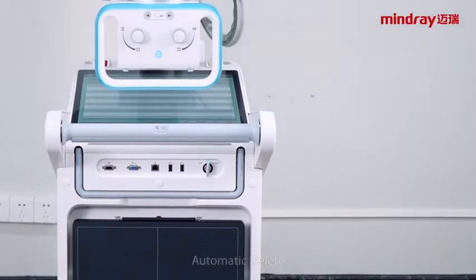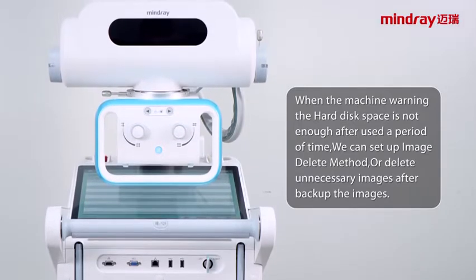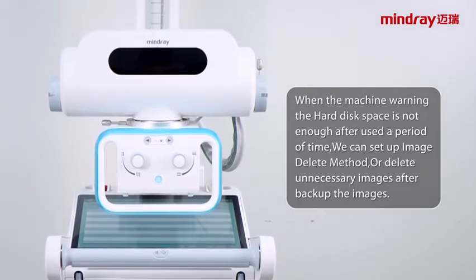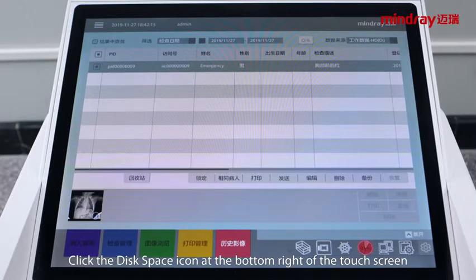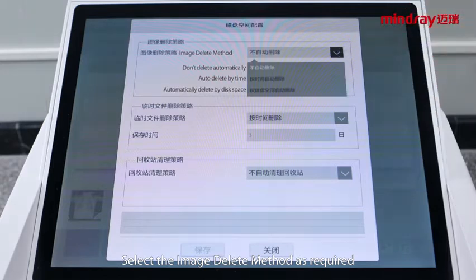Automatic delete, backup, and recovery of patient data. When the machine warns that hard disk space is not enough after a period of use, you can set up an image delete method, or delete unnecessary images after backing up. To set up the image delete method, click the disk space icon at the bottom right of the touch screen. The disk space configuration window is displayed. Select the image delete method as required.